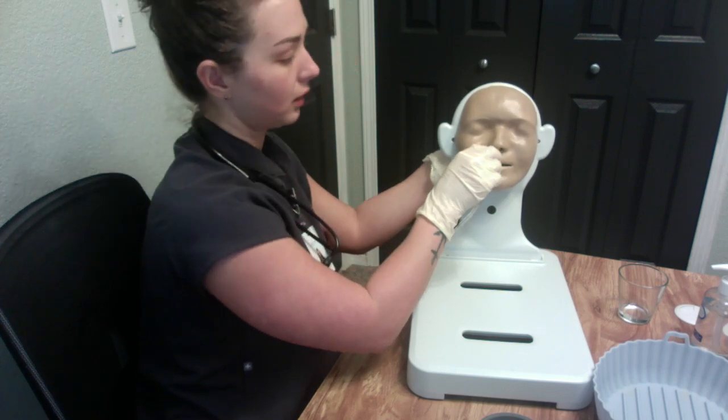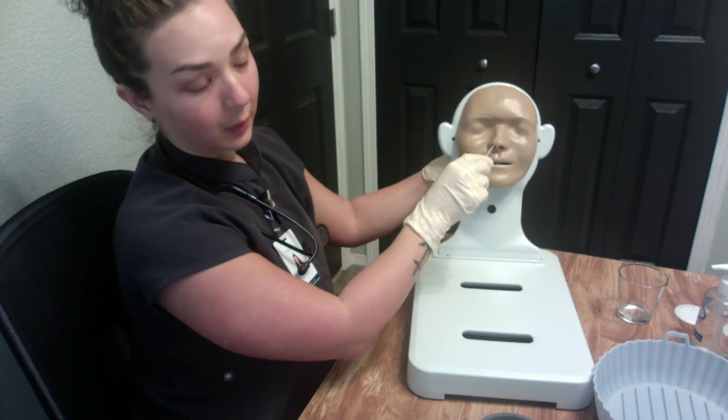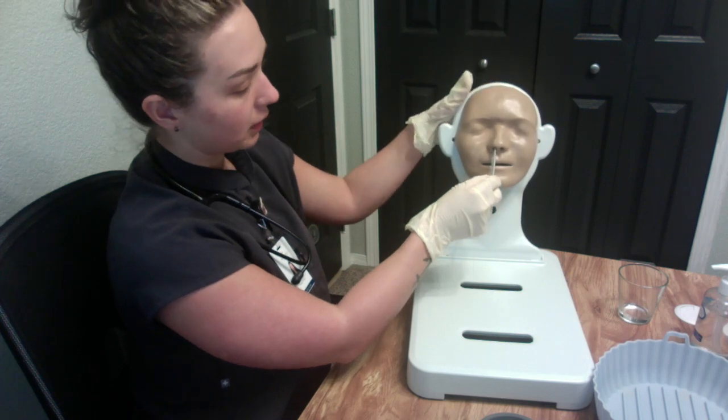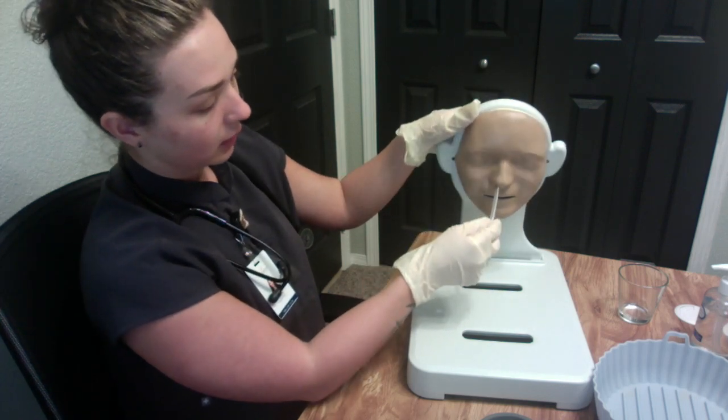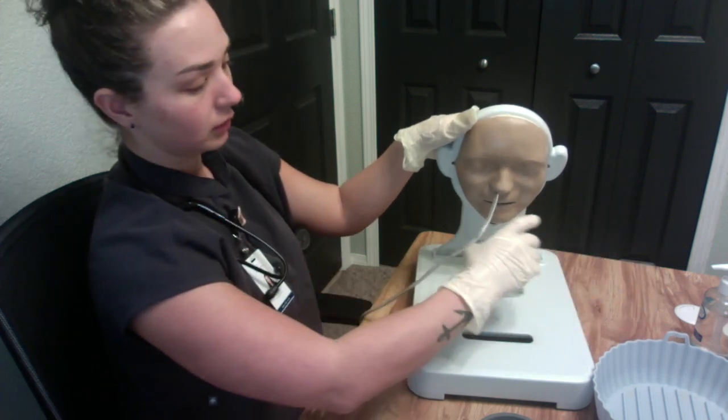All right, we've hit the oropharynx, so now we're going to have them lean forward because at this point they're going to start to gag a little bit, so we would have the patient lean forward. If needed, have them take a drink of water.